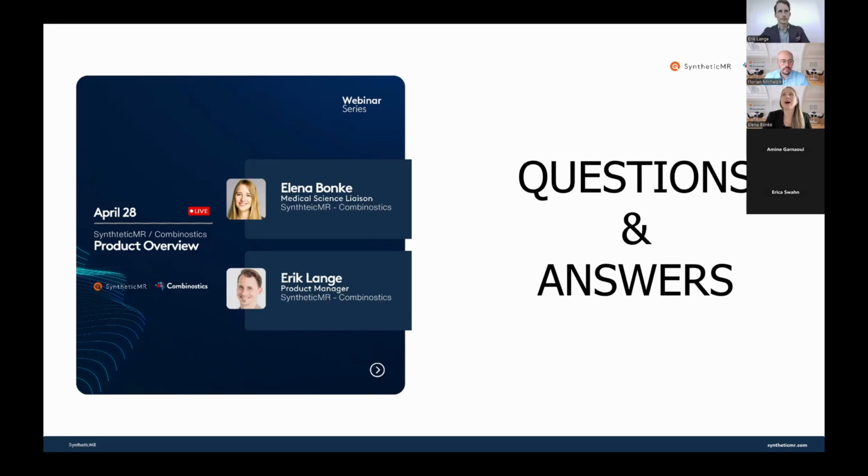Okay, I see. Every time you're introducing a new solution, I think everybody wants to make sure that the solution works to satisfy your own needs. So, of course, in the very beginning, it could take another 1-2 minutes extra, let's say, to review the outputs. But really, the goal is to not increase the reporting time, but really to shorten it. And that's what we see once our users are settled in with using the software.